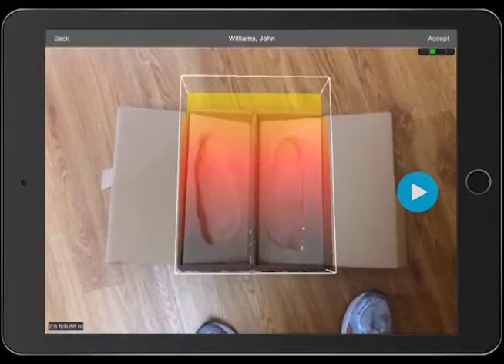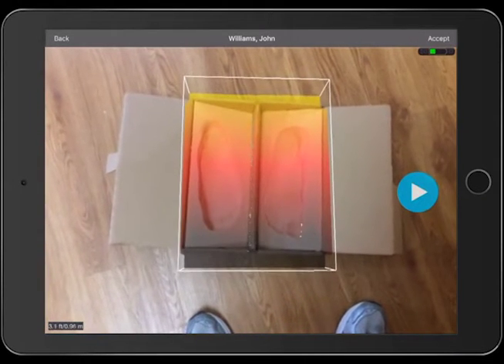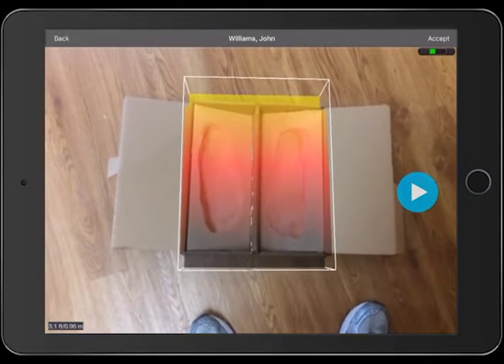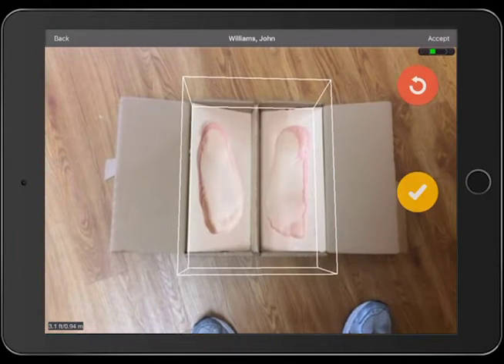Start with the heels furthest away from you. Line the transparent block over the casting box. Be sure all the foam is inside the block. When the casting surface is set, tap on the play arrow icon to scan.